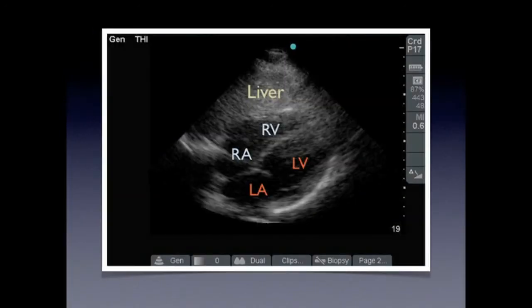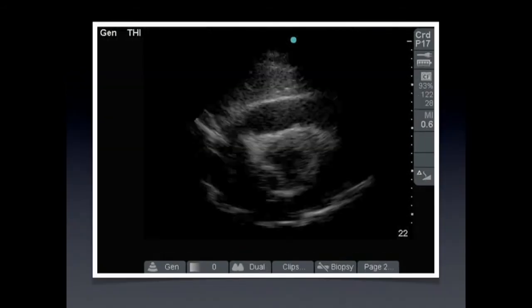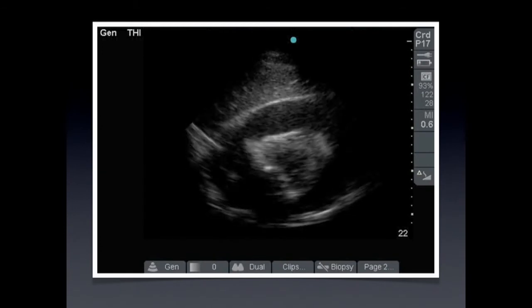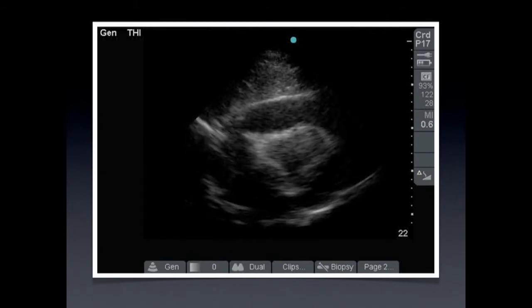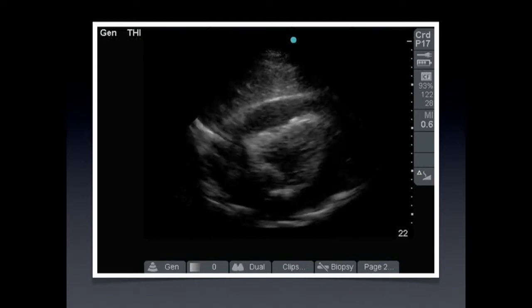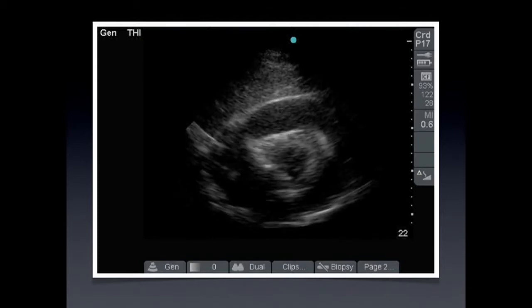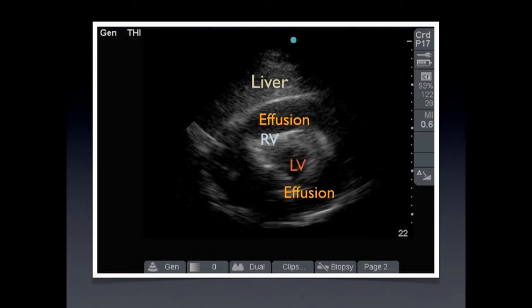Now let's talk about tamponade. Looking at the heart in the subcostal view, you see the liver, the right ventricle with the right atrium, the left ventricle, and the left atrium at the bottom. When you do have an effusion, you can have a tamponade effect. In this case, we see the same view, but note how the heart is surrounded by fluid and you cannot even see the right ventricle — there is collapse of the right ventricle and the right atrium. That's indicative of tamponade on ultrasound.